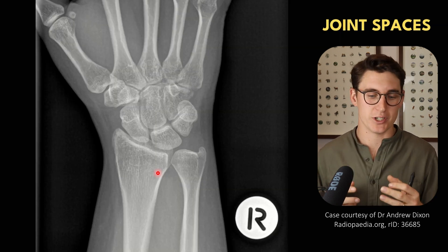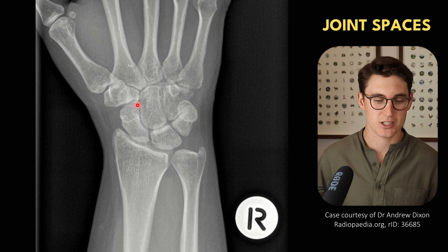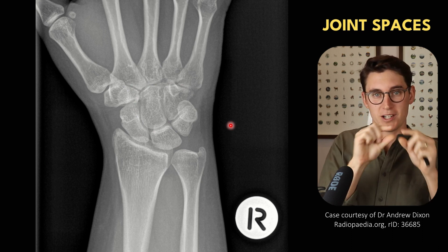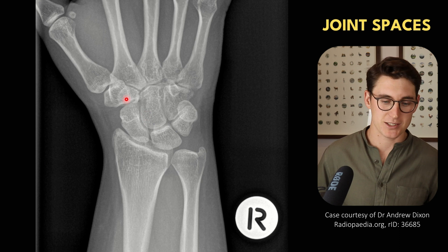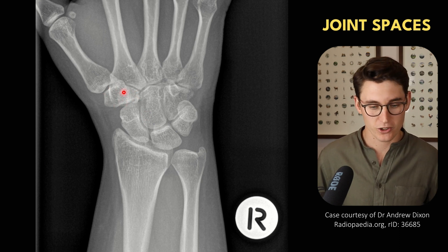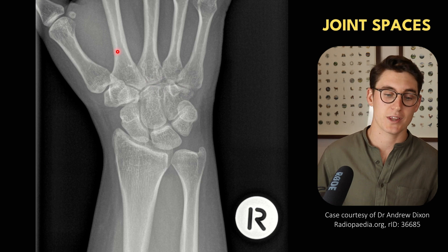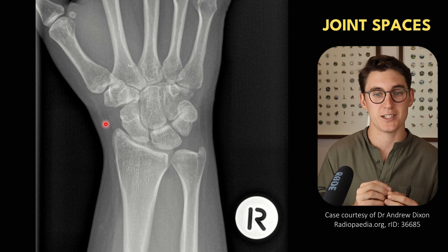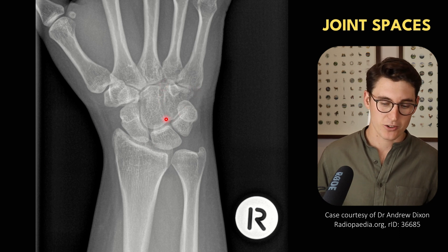Now that we've covered the actual bones within the wrist, let's look at the alignment of the wrist. The first thing you want to do is assess the space between the wrist bones themselves. We want a generally even space between the bones. The bones have formed complex shapes around one another, so some spaces like between the trapezium and trapezoid won't be visible very well. But the spaces we can see — like the distal row articulating with our metacarpals and between our scaphoid and capitate — we can follow all the way around to make sure we have even spaces without obliteration or expansion.